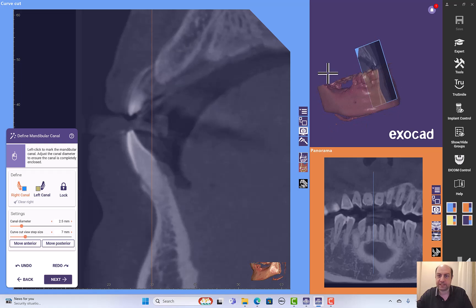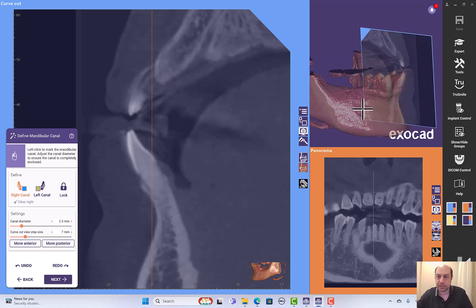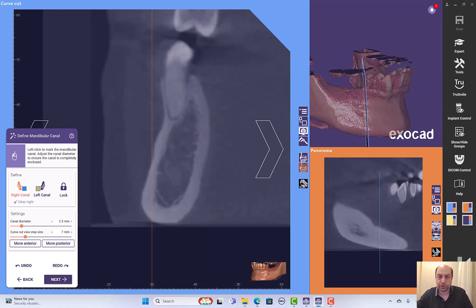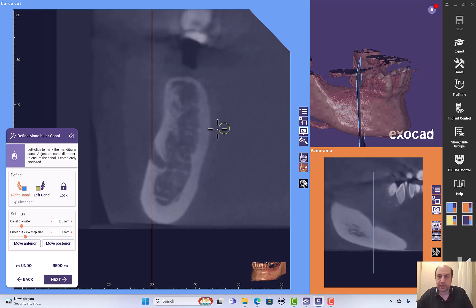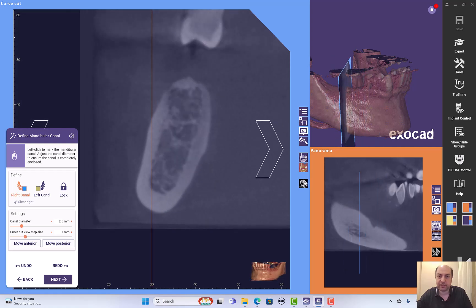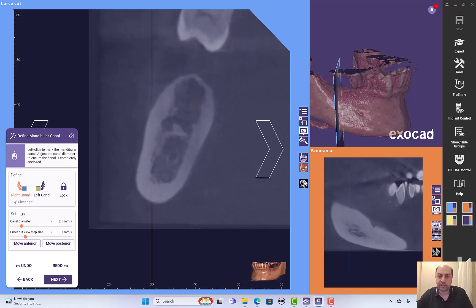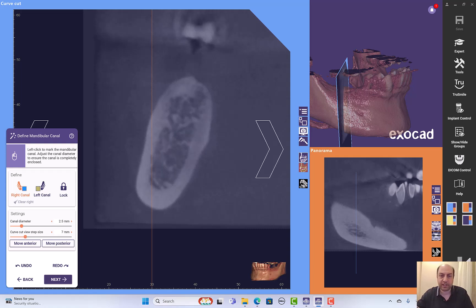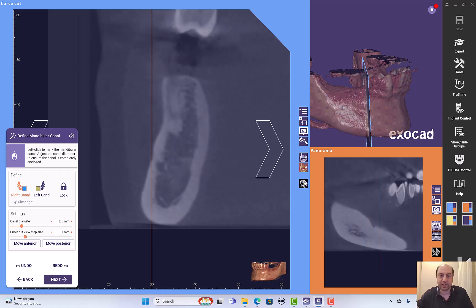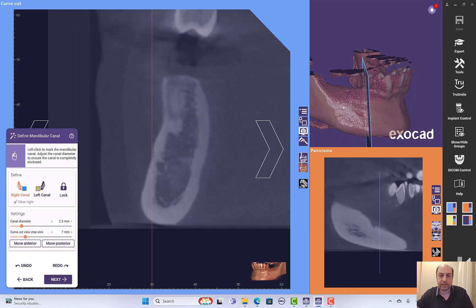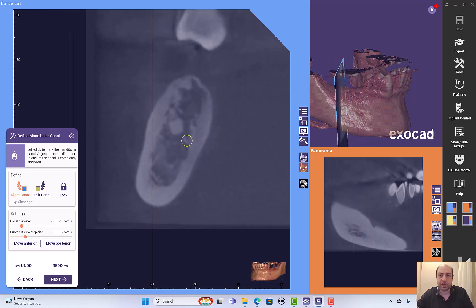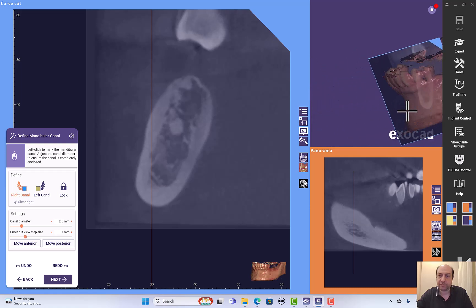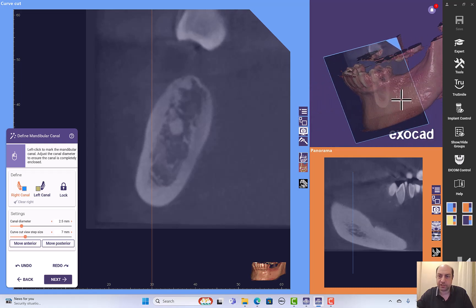To place the cut, just left click. For example, here I'm in the mental foramen and still I can navigate by using right click, stepping on the cross-sectional cut. Right click and keep pressing on the mouse, you can move backwards and forward. If you want to go to any other area far from this area, you can just left click on the 3D and you have it.